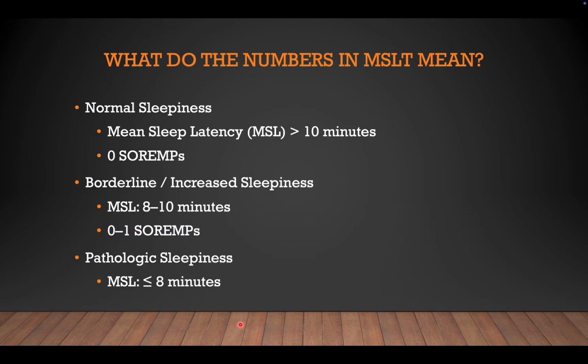As I discussed earlier, the MSLT is done to find out two important findings. One is the mean sleep latency, which is calculated as discussed earlier, and the other is whether there is a sleep onset REM period or not. Normal sleepiness is a mean sleep latency greater than 10 minutes, and there are no SOREMs. That means the patient is normal. There is no excessive daytime sleepiness. EDS, idiopathic hypersomnia, narcolepsy, etc. are somewhat ruled out.